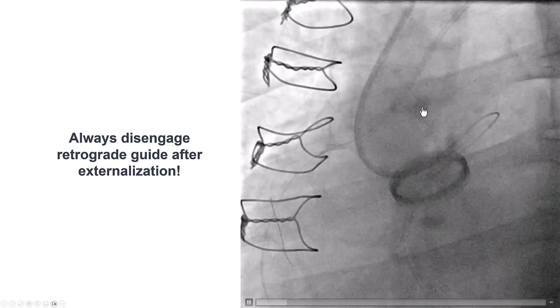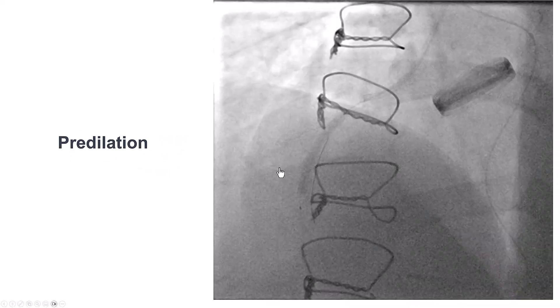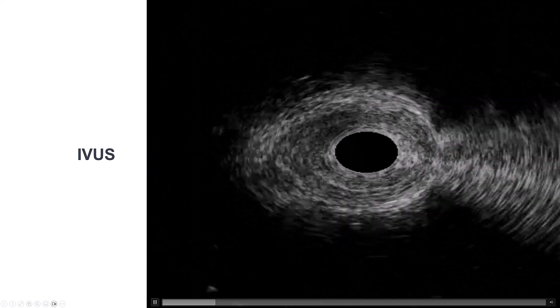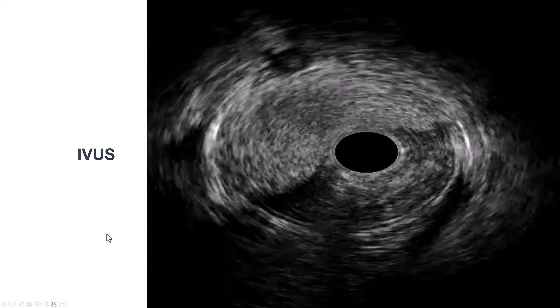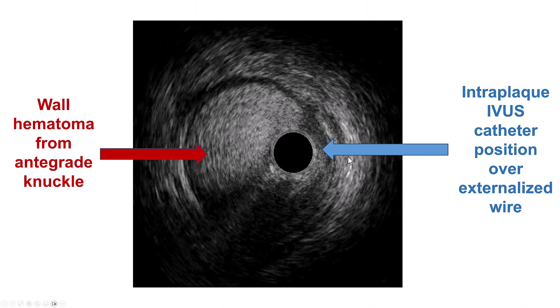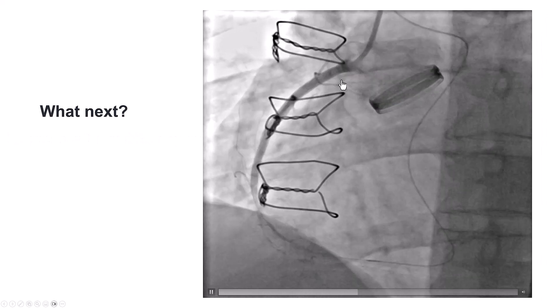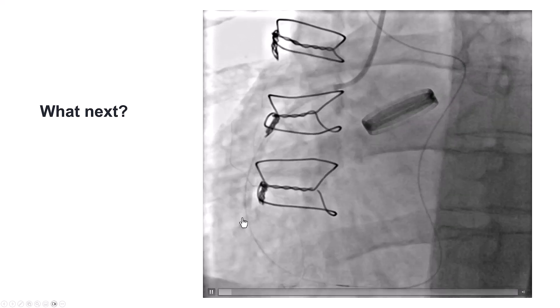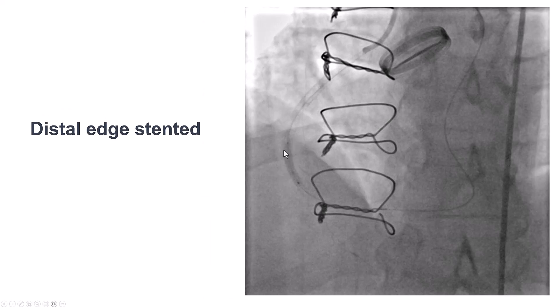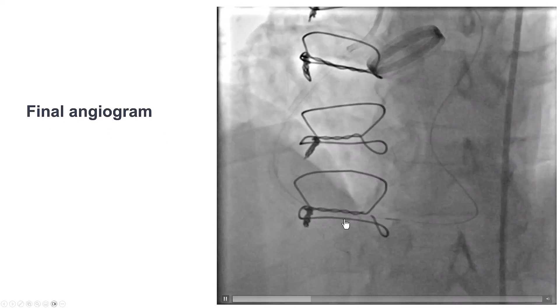After externalization, the first step is to disengage the donor guide so there is no potential injury on the donor vessel if there is movement or difficulty delivering. Then pre-dilation was performed and intravascular ultrasound was done. We see that we have been in the intraluminal space for the most part, with some areas of hematoma from antegrade wire manipulations — but essentially true-to-true crossing all the way from the proximal cap to the distal cap. Drug-eluting stents were placed. Unfortunately, flow was not very good; the vessel distally looked diffusely diseased with a possible dissection. An additional stent was placed at the distal edge, which provided good flow into the PDA and the right posterolateral.